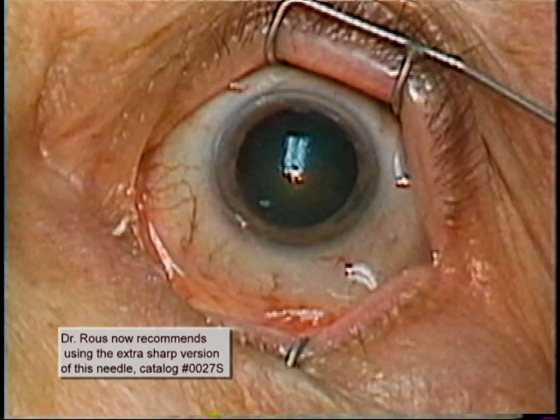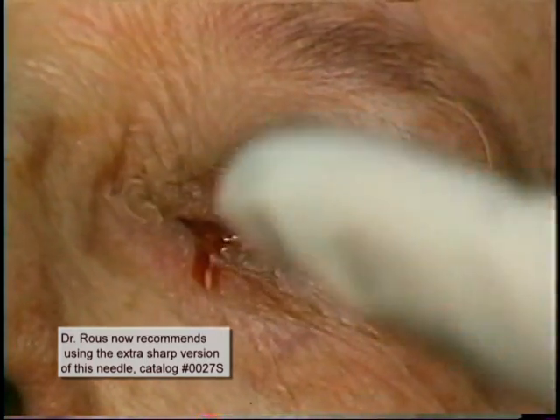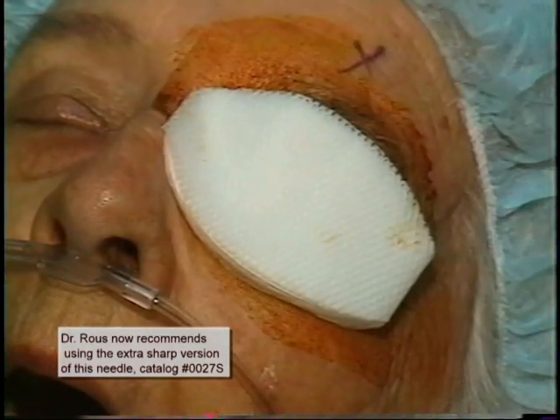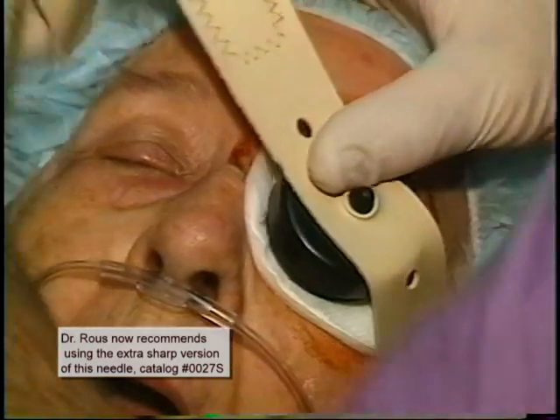This needle tip, as it was passed, was a little too dull and did not penetrate conjunctiva and Tenon's as easily as it should have. In fact, if a needle tip is too dull, just change it for another needle. My basic recommendation is not to push against resistance ever, since the needle should easily penetrate conjunctiva and Tenon's and pass very easily around the globe. Betadine instillation of 5% betadine, swabbing of the lids, and placement of the patch and Honan's balloon are done in the usual way.